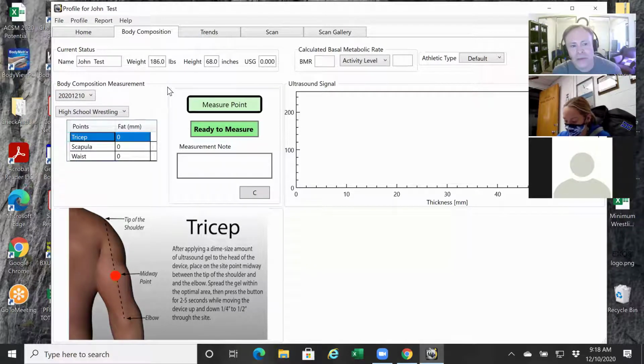Last but not least, the optimal duration of the measurement: 3 to 4 seconds tops. Okay, so I'm going to guide you through exactly how I do this, show you the most efficient way to do it, and we'll talk about the second component that's going to ensure your success with accuracy with this thing. The first being those 4 things I had you write down.